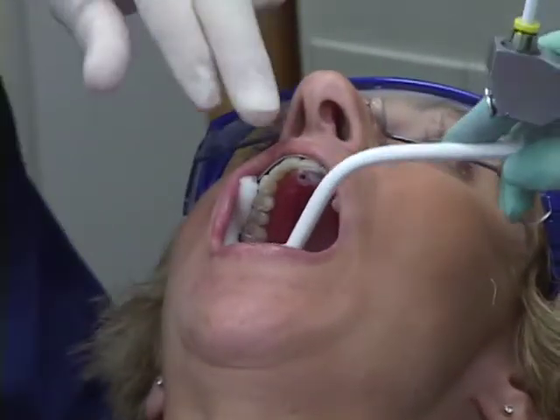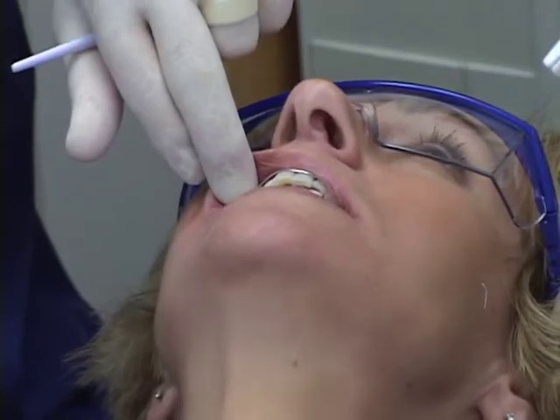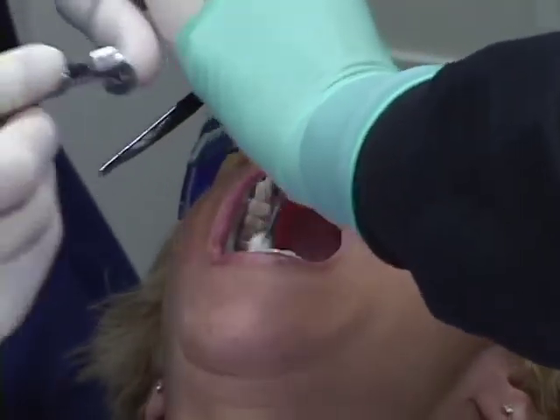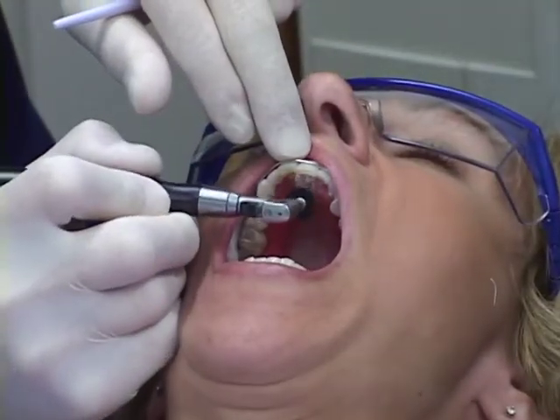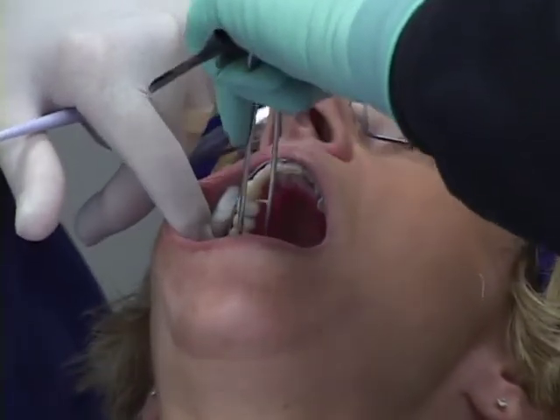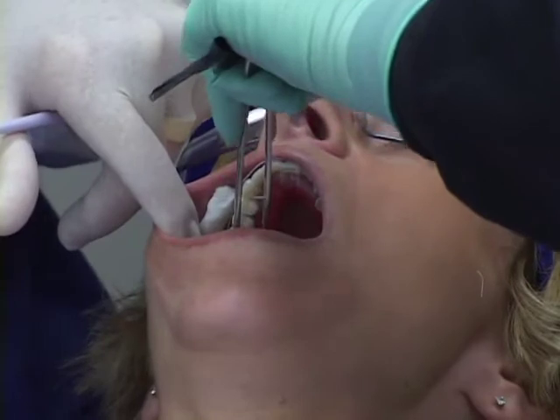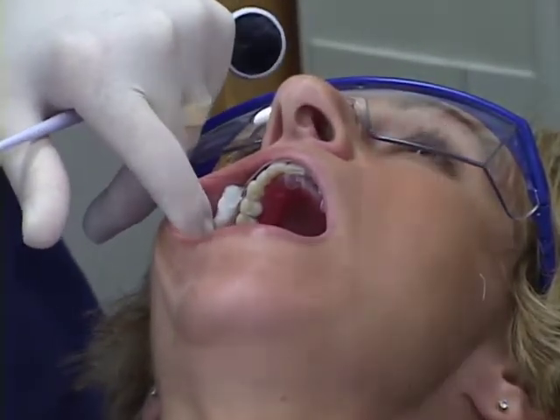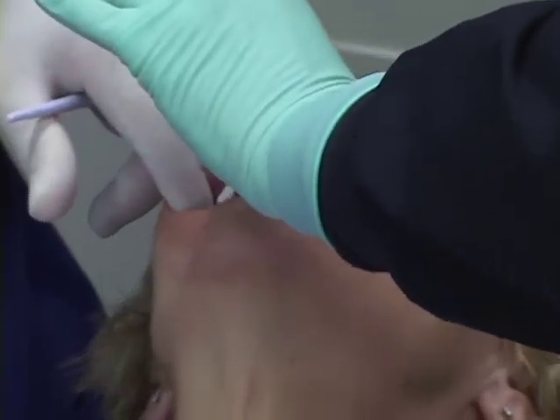Back up. Go ahead and close now. Okay. What do you feel? What are you aware of? You still on that right side? Yeah. Okay, open here. I'm going to close down a little more here. Good. And you want to keep changing that black film, okay, Donna? And get nice fresh film there. Cut. Okay.